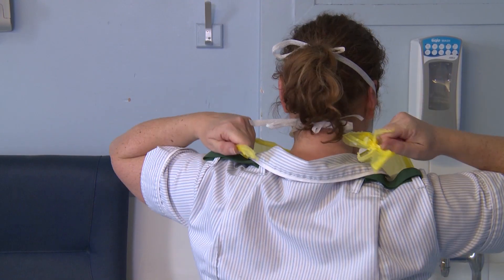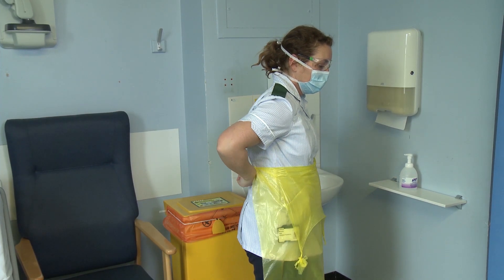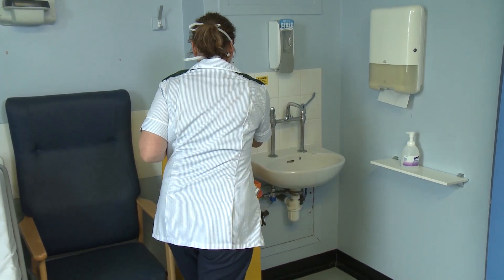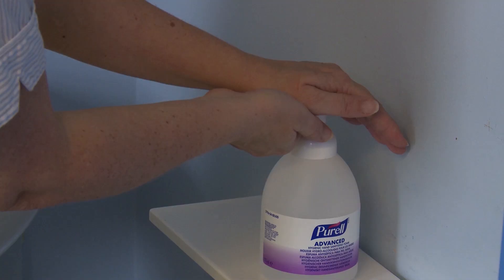Remove apron. Unfasten or break apron ties and pull away from the neck and shoulders, touching the inside of the apron only. Turn apron inside out, fold or roll into a bundle and discard.